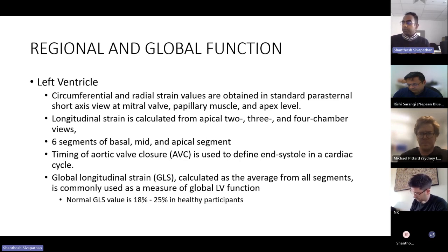Unfortunately, maybe later on in one of the sessions we might be able to do this, because I tried to do a hands-on session, but the patient's name kept coming up. So, confidentiality. Maybe once I'm more prepared, we can do a couple of examples on how to do strain. I've got a paper that looks at how to do strain in more detail a bit later on. Yeah, I can bring it hard. I think your strain would be just phenomenal, right?